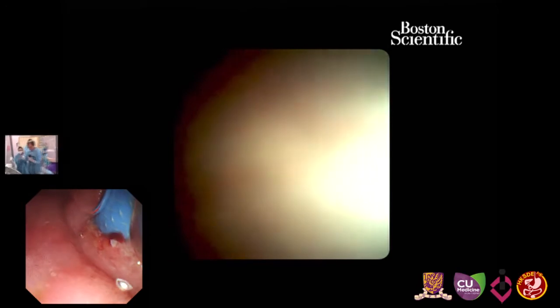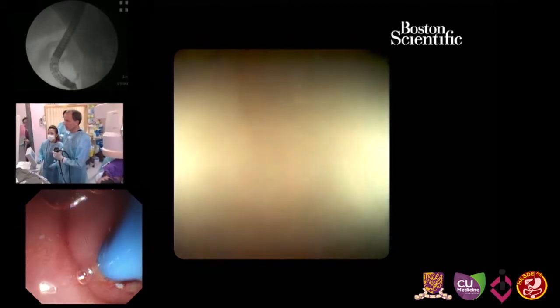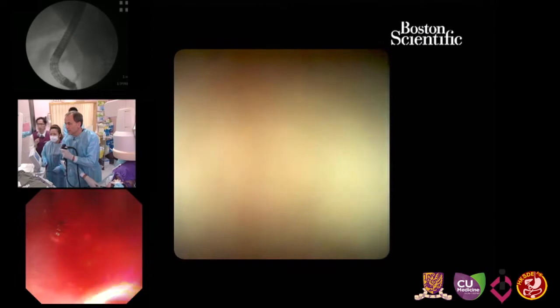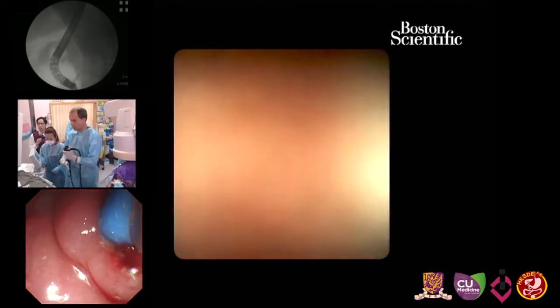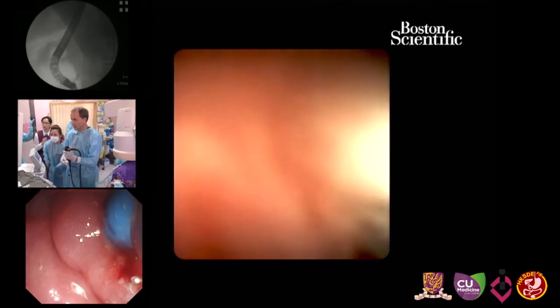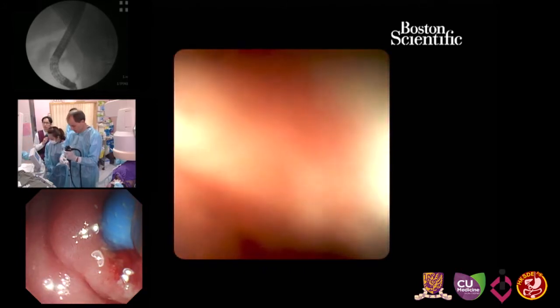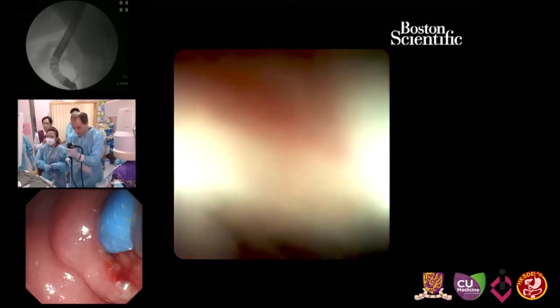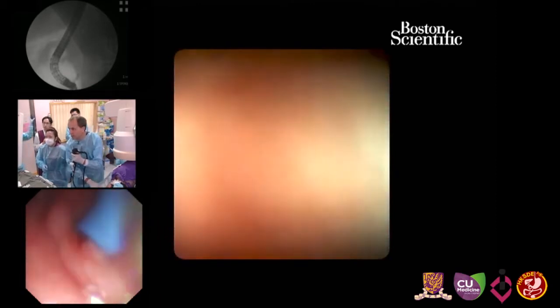So, welcome back. We had some problem with sedation of the patient and we had to discontinue the procedure for a while. But now we are back. The patient is now in the left lateral position, so it's a little bit more difficult now to maneuver the scope. We already performed the balloon dilatation of the pancreatic sphincter.